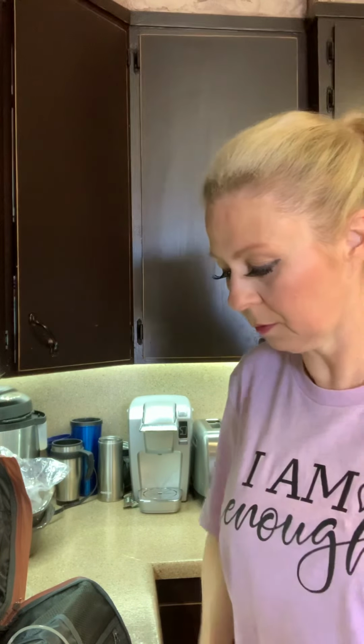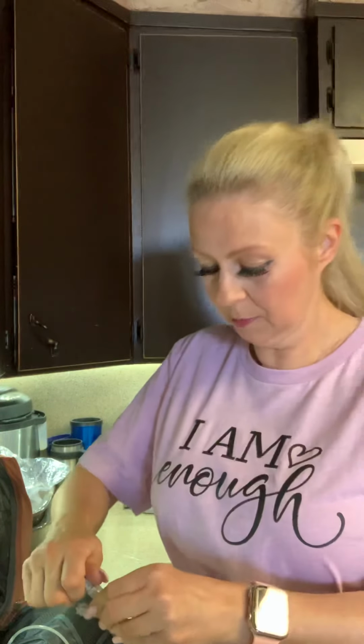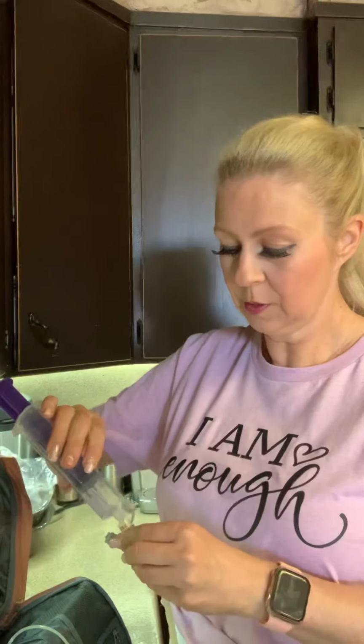So what I'm going to do now, before I move on, is I'm going to pull out my tube. So this is the tube, and it is attached into my belly right here. And it's like a port. It's a hole into my stomach. And I am going to push some water through here. And so this is actually pushing right into my stomach. I'm flushing the tube, giving myself hydration.